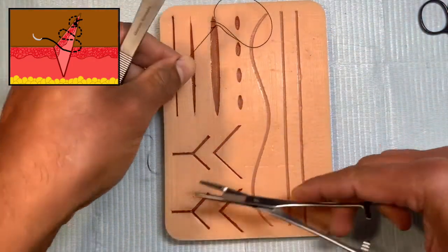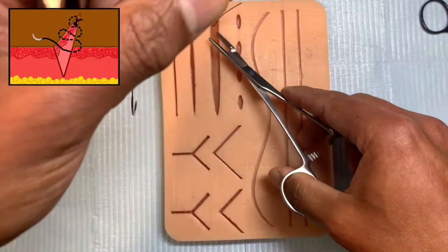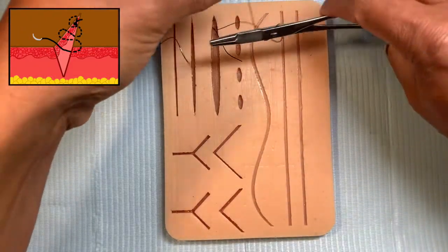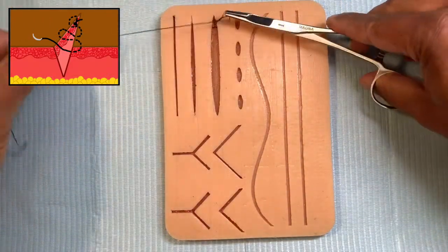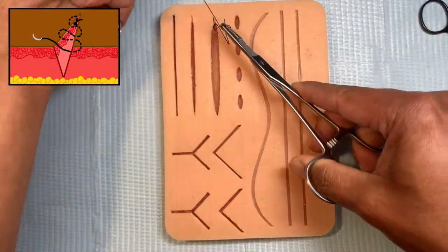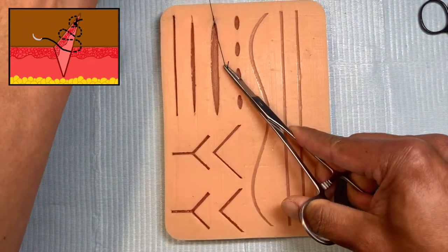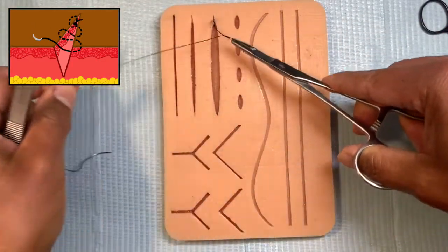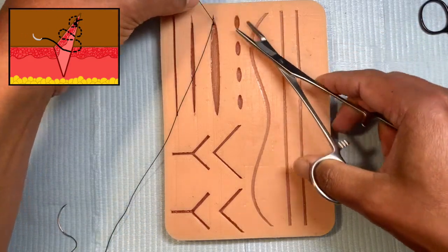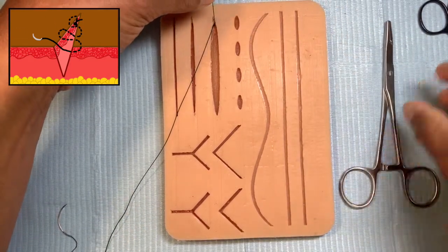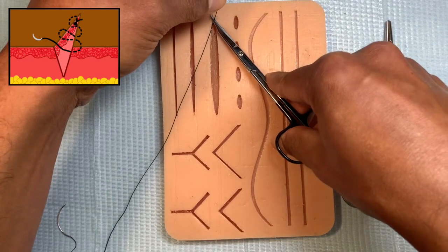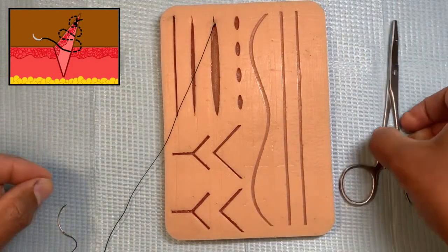This is exactly as you would see in the deep dermal video. You've got the shorter end and you go reverse two, then one forward, then one reverse. It's basically a 2-1-1 type of configuration. Once you've done that, take the shorter end and cut it just above the knot. Make sure you don't cut the knot because it can lead to the stitch getting pulled out.